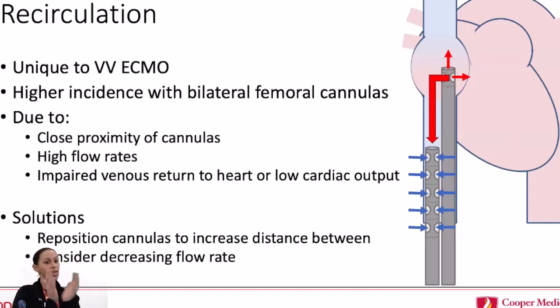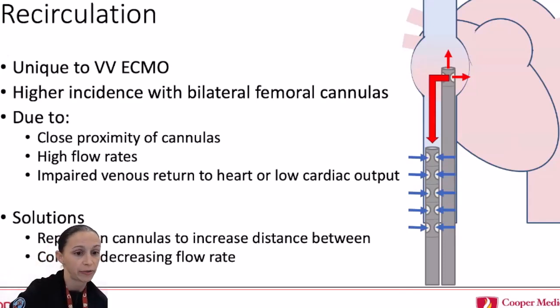Now, the same color is pretty dramatic recirculation, so you can't look at your cannulas and say, oh, there's a color difference, and use that as a sensitive test to rule out recirculation. In fact, there are formulas where you can figure out the fraction. But if you do see that color change not there, that's a problem, and you're probably recirculating.